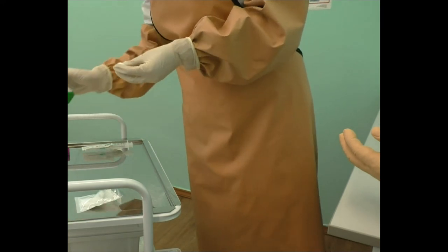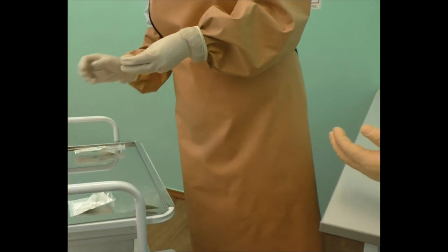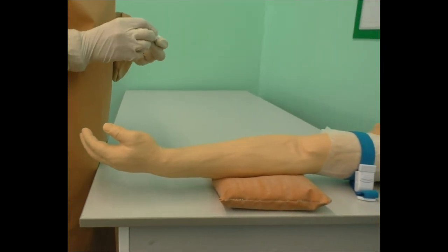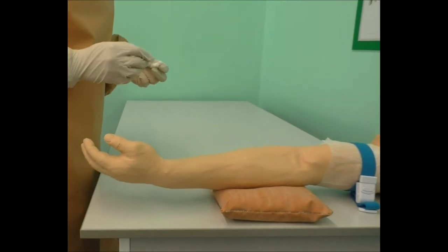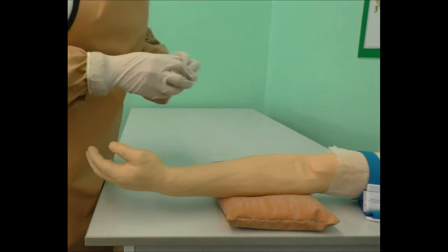Apply gloves and clean the skin. The first cotton ball wet with antiseptic is used for an area of 10 by 10 centimeters. The second one covers 5 by 5 centimeters. The direction of cleaning is from periphery to the center. Ensure that the area is dried and wait for the exposure time.